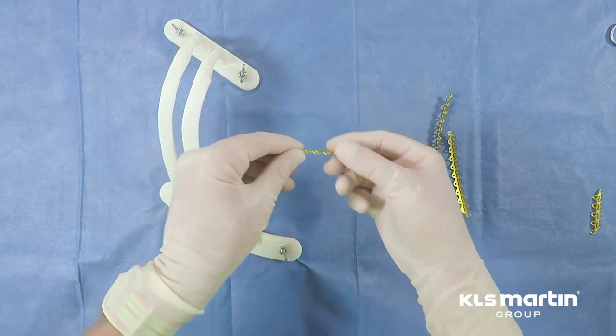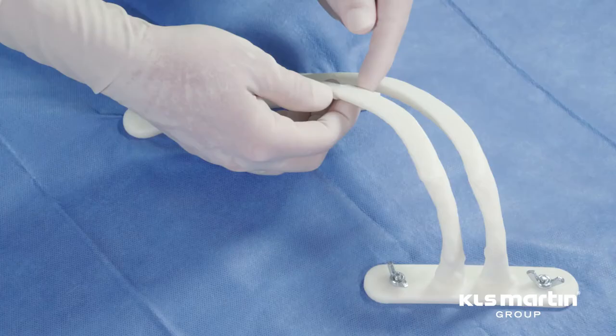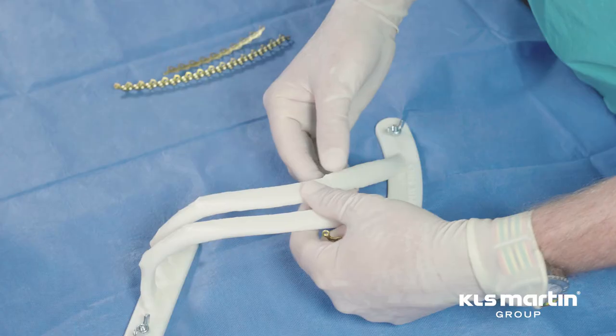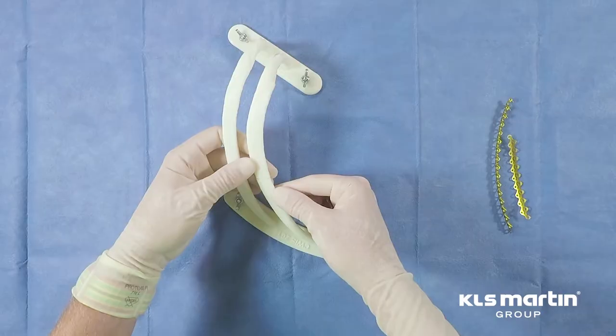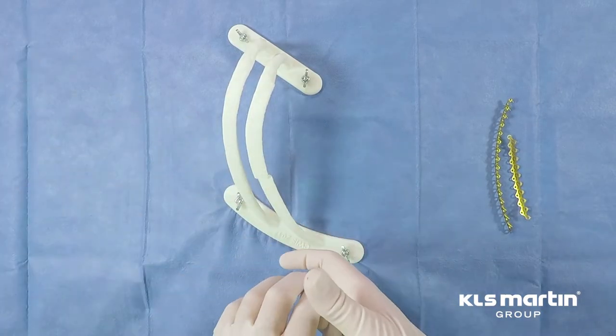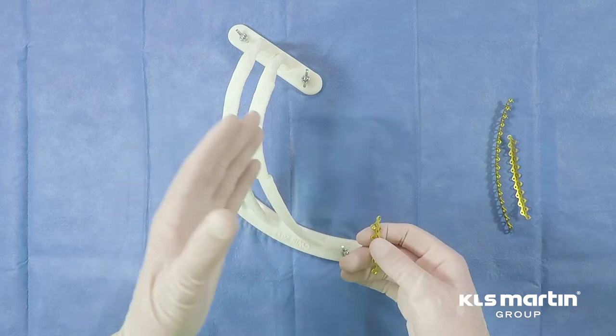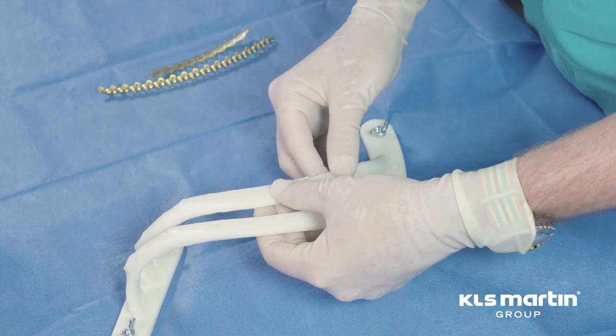We are going to demonstrate application of rib plates to a model. This is a 3D printed plastic model that is an exact replica of a human 7th and 8th rib, and we've created a rib fracture here that we will reduce and plate with a 10-hole plate.